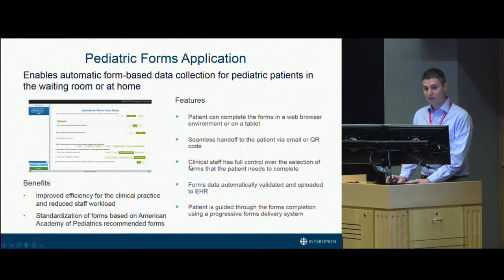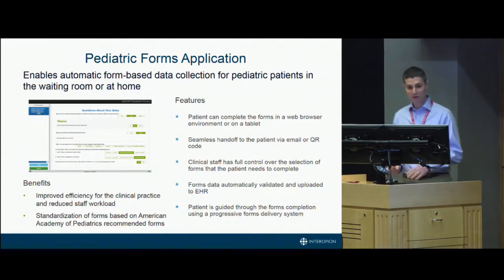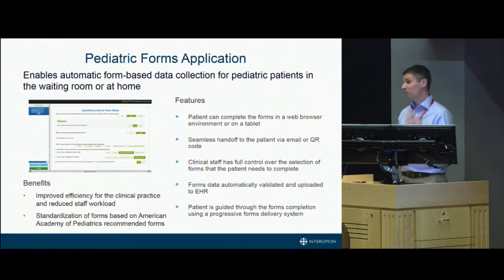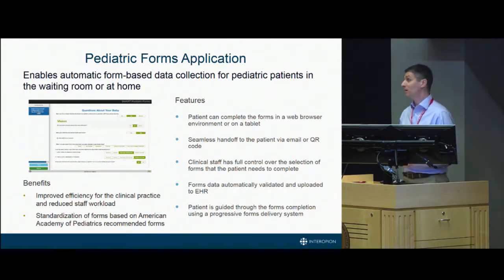So it has a number of great features, such as a seamless handoff to a tablet. We can use a QR code, or we can actually send an email to the patient. The clinician has full control over the forms which are to be delivered to the patient. The form's data is automatically validated and then stored with the EHR. And the application takes care of guiding the patient through the forms completion process. Also, the application has a localization feature where we can deliver the forms in any number of languages.